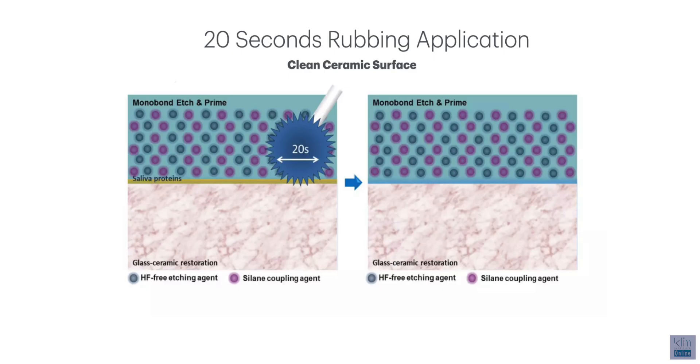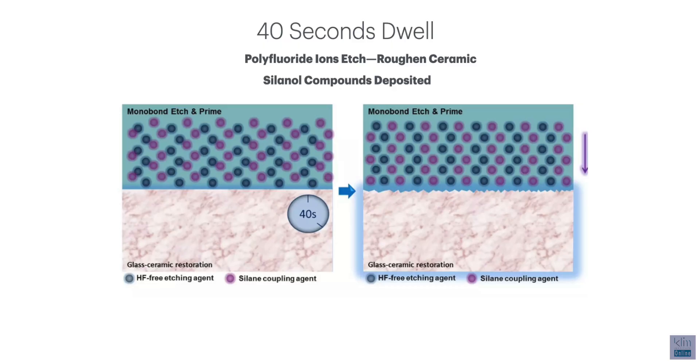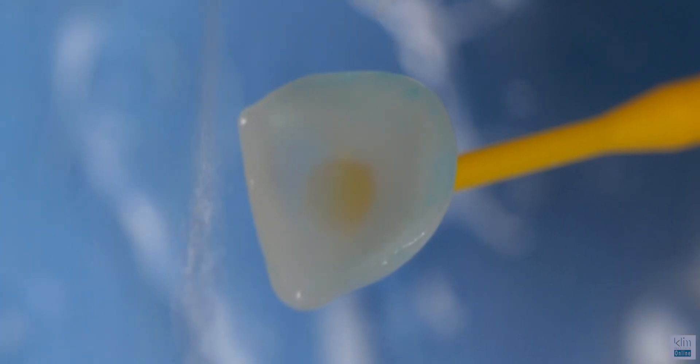So why the scrubbing? The scrubbing is there to clean the surface. One nice thing about this agent is that I don't have to place my ceramic in an acetone bath to clean it any other way. You can actually take it straight from the try-in in the mouth and use this to clean it. The first 20 seconds, you're going to scrub — that ammonium polyfluoride is starting to clean and condition the ceramic. After the scrub of 20 seconds, we let it dwell for 40 seconds. During that dwell, it's actually etching the ceramic and roughening the surface for an optimal bond, and it starts to deposit the silane compounds onto the ceramic surface. Then as you rinse the system, it removes the ammonium polyfluoride, which initiates the next phase of the silane bond.